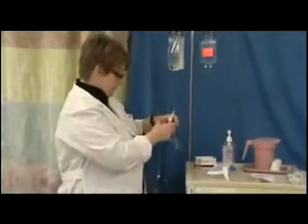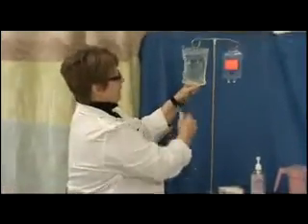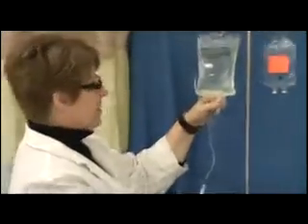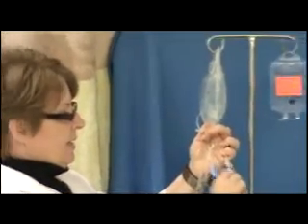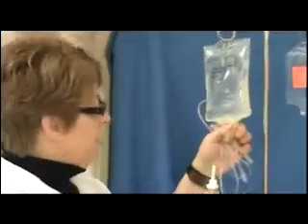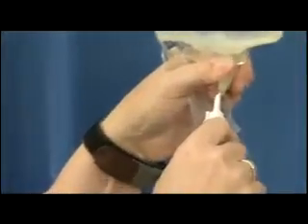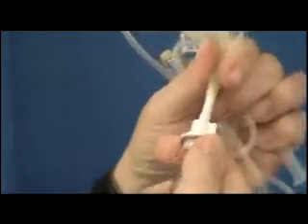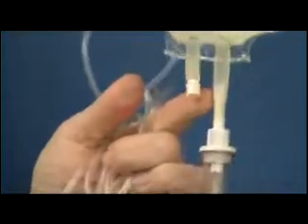What we will do now is uncork or unplug our bag like so. And while we're holding that, we'll take the spike out of its holder without touching it against anything and carefully insert it into the port on the primary. And we roll that in to position.